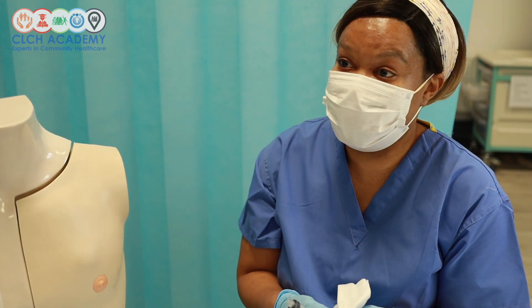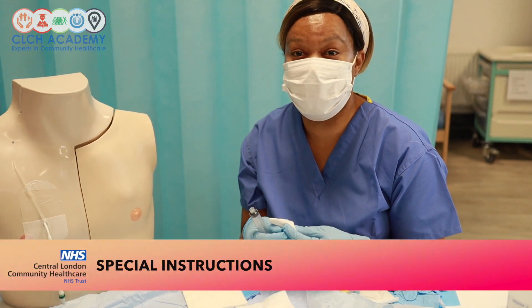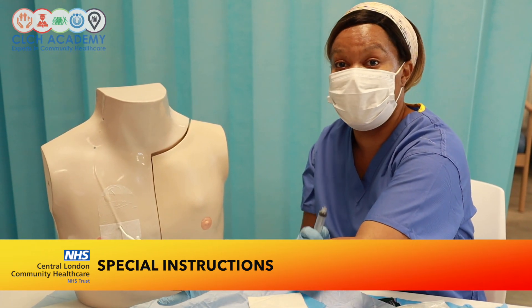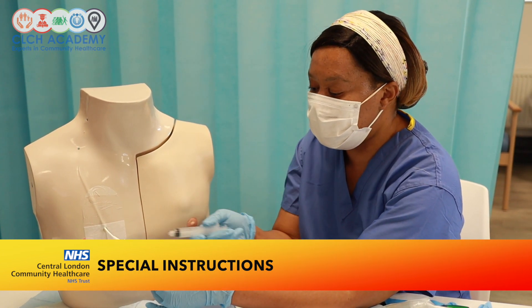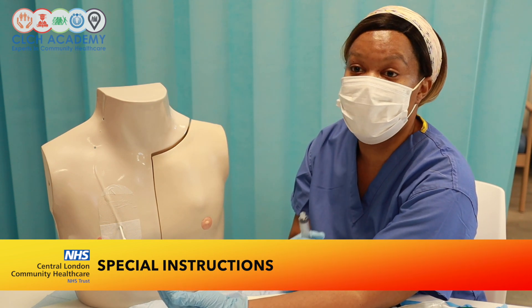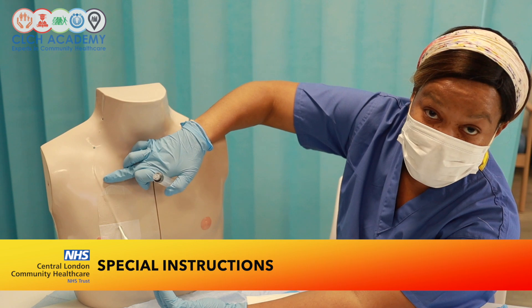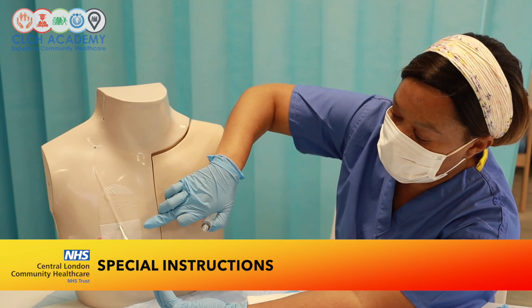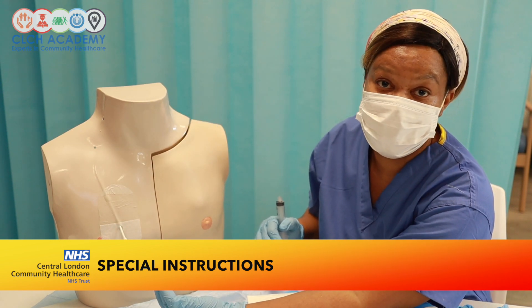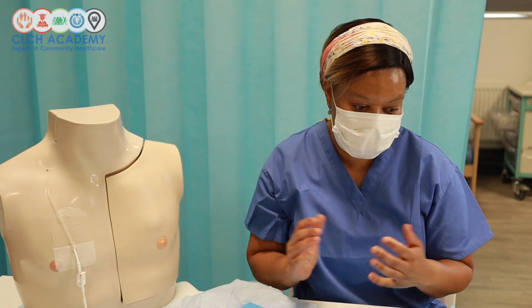The PICC line is now flushed and ready for medication administration. A commonly asked question is whether to draw back on the first attempt — I may draw back to check for blood return, but if there's no blood return I'll attempt to flush, and if it flushes clearly with no signs of occlusion the line is still patent. Watch for redness tracking upwards along the line or bulging as you flush, which indicates fluid is going into tissues rather than the vein.